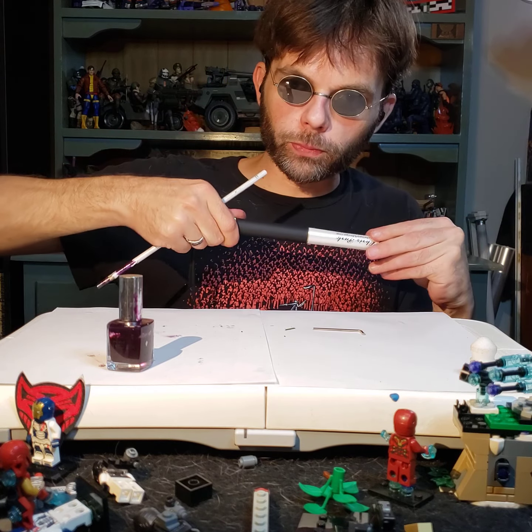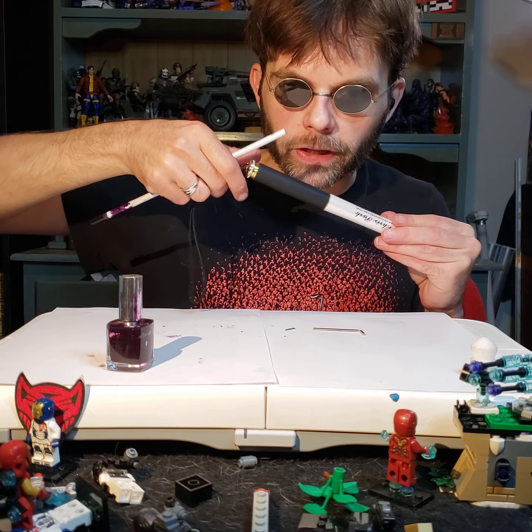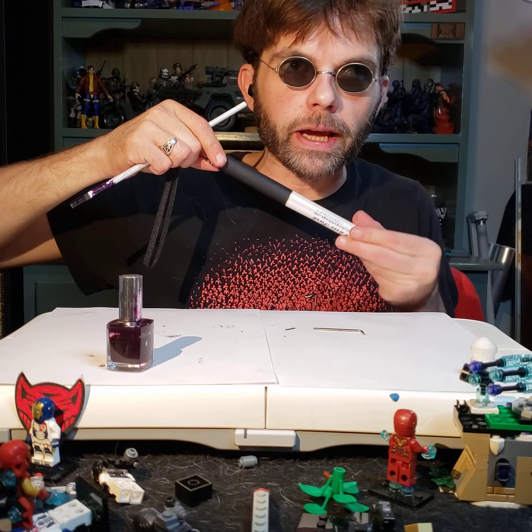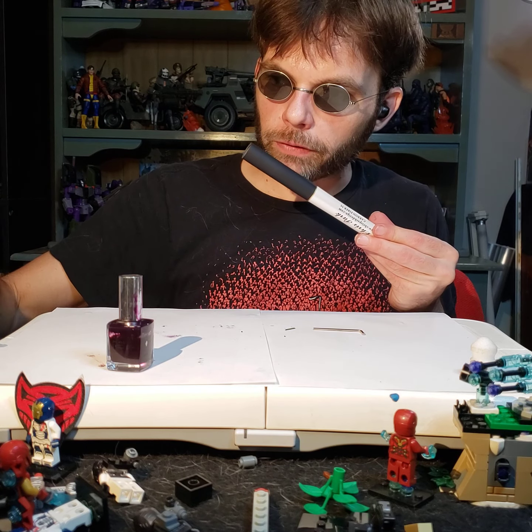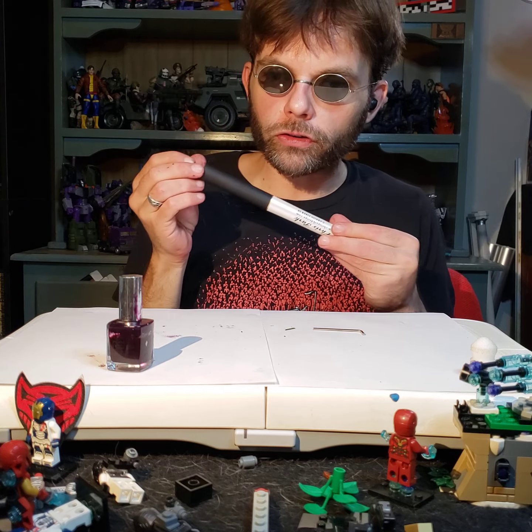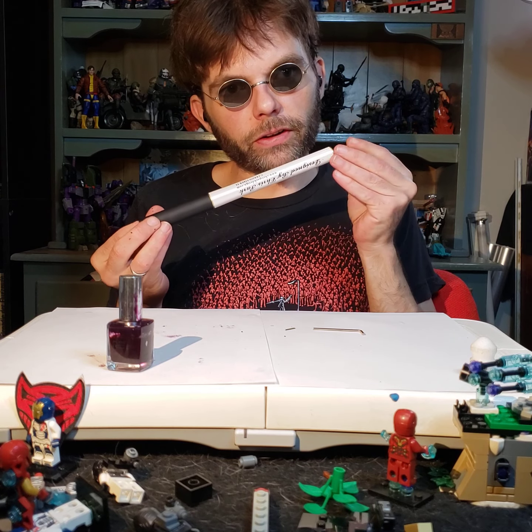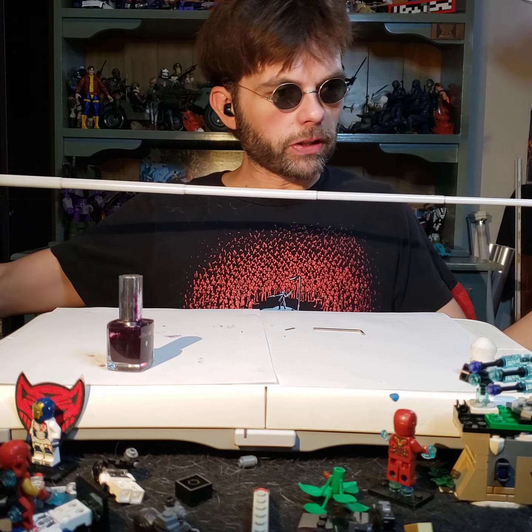Now, this will make it last a lot longer than it would have before doing this, because you're actually putting on a thicker layer with the nail polish than the roughness of the cane had before. So we're going to set the cane cap off to the side, and we're going to slide our tube in here. Now this part feels like it's a little bit thicker than normal, so we may have to give it a little oomph to straighten it all out. But let's take a look.